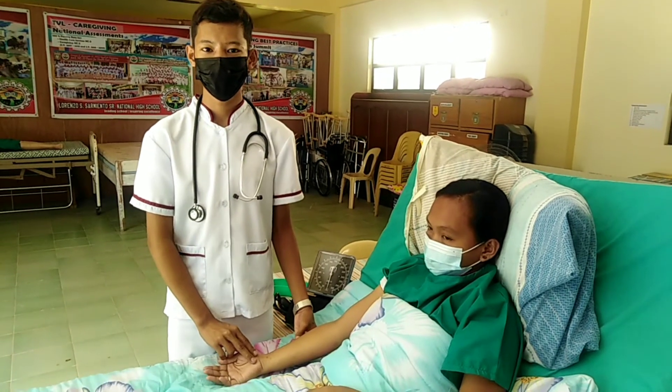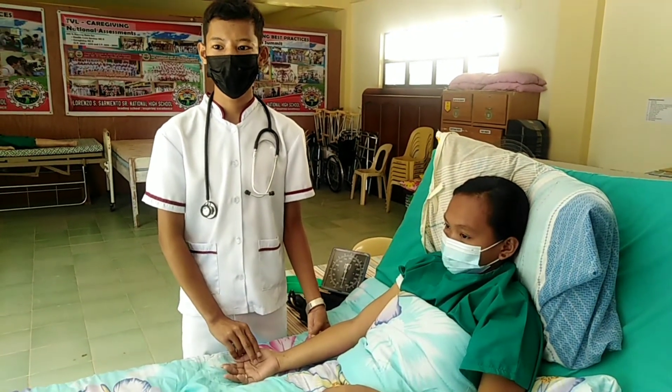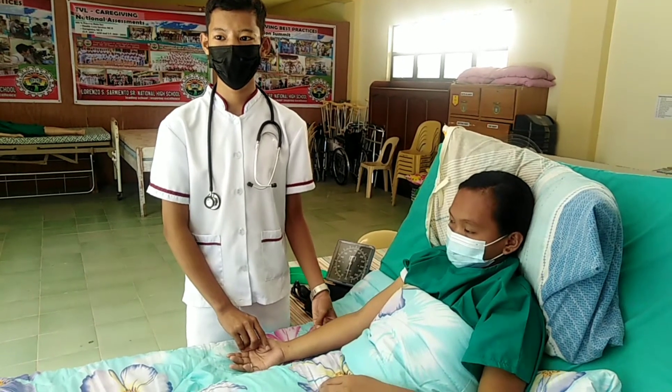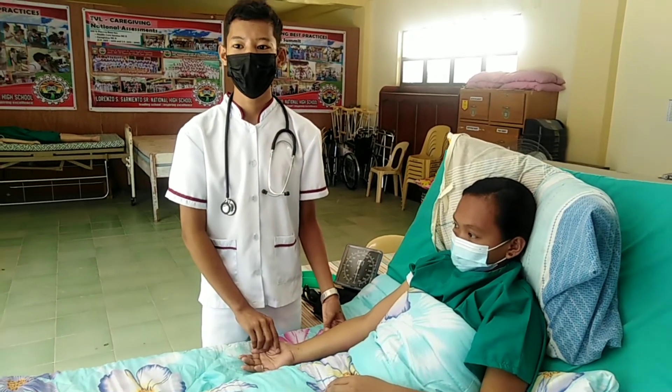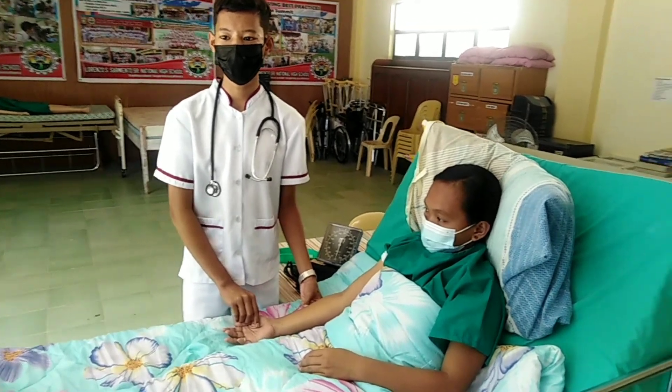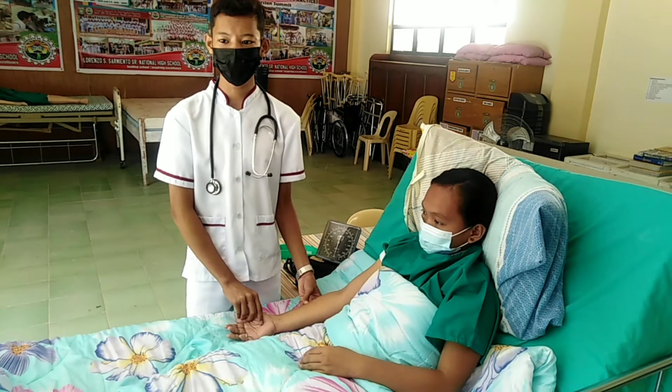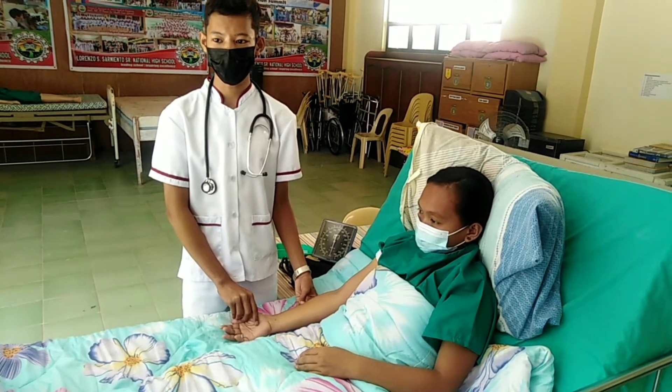Palpate the brachial artery. Center the cuff's bladder approximately 2.5 cm or 1 inch above the site where you palpated the brachial artery. Wrap the cuff snugly around the client's arm and secure the end. Check that the manometer is at eye level with the client's heart.